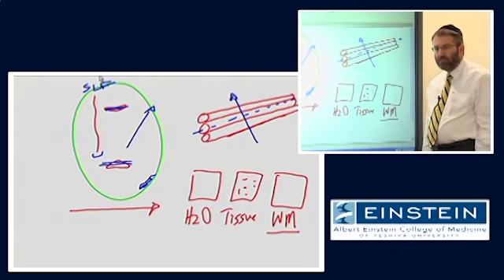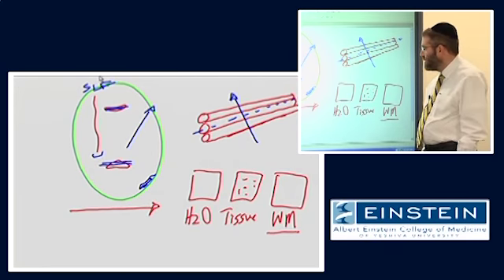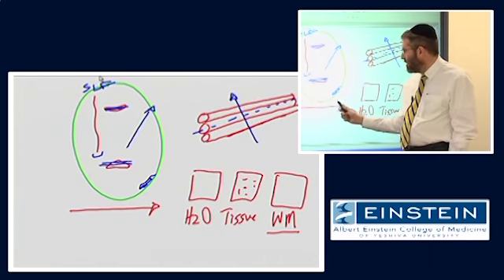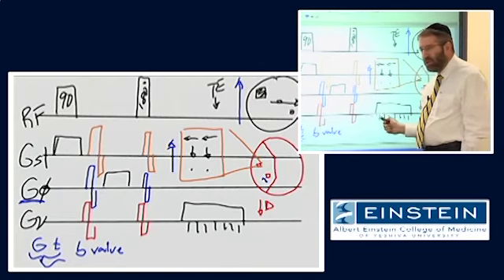Question? Yeah. Will you be able to get velocity from these images? Sure. This is a diffusion-weighted image like any other. The only difference is that to acquire this image, we only turned on one direction.